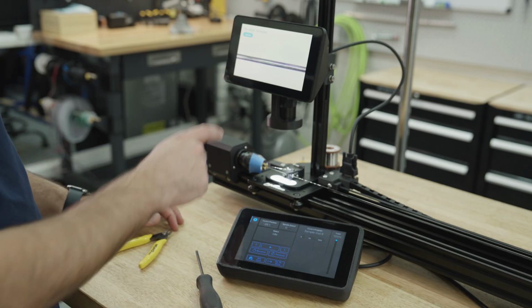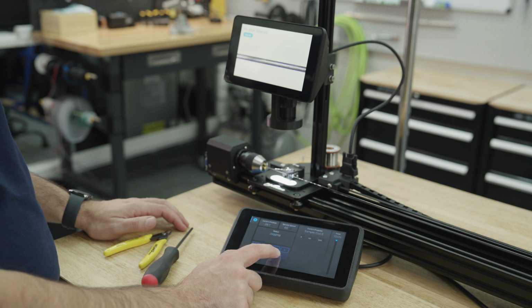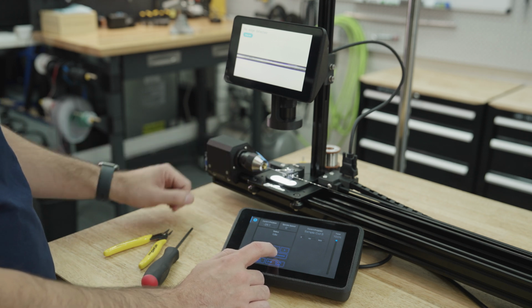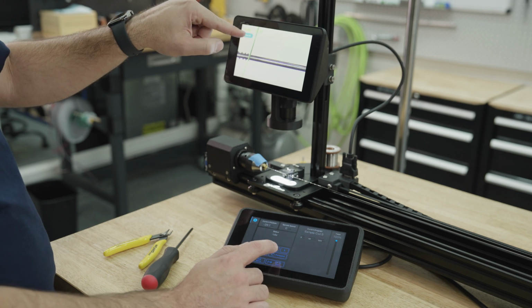Now let's jog the machine forward to bring the coil into view. Press the forward button to jog the machine. This turns the spindles forward. You can also jog it reverse, but you can't go back because it'll loosen the wire. Once the wire is in view, the angle pilot will automatically detect the angle.